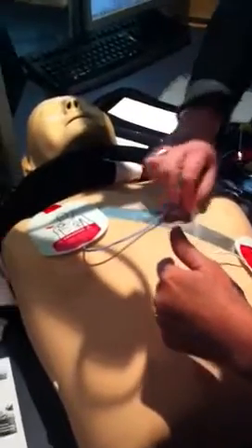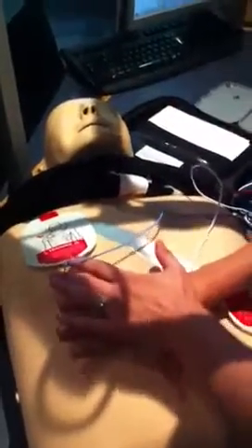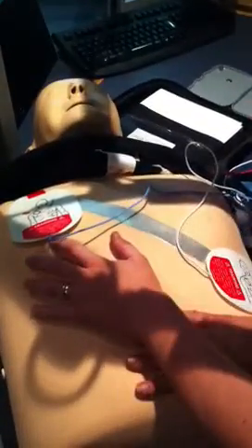It's going to tell you for help with CPR, press the flashing blue CPR button. But that's okay to do when the paddles are all in place. Okay, so you'd actually now leave this in place until the ambulance arrives. You're going to do 30 compressions, 2 breaths, and after about a minute, this thing will tell you to stop, and it will have another look, and it will give another shock if it needs.